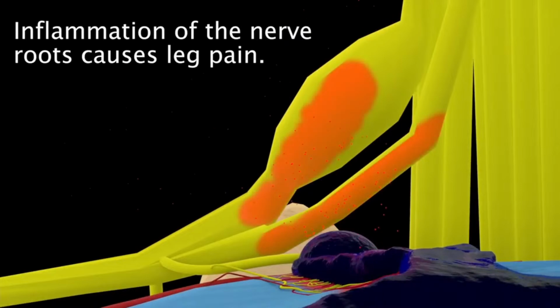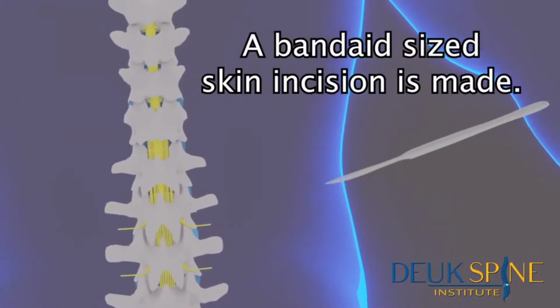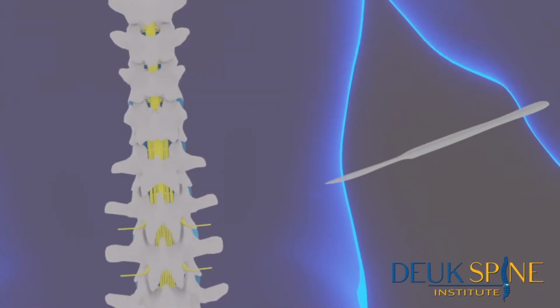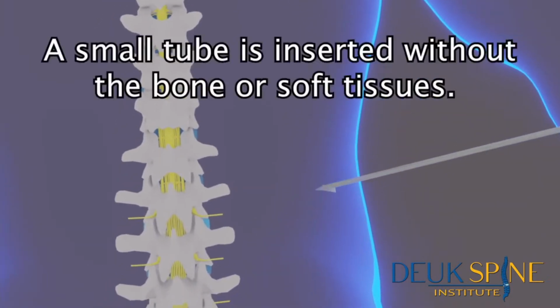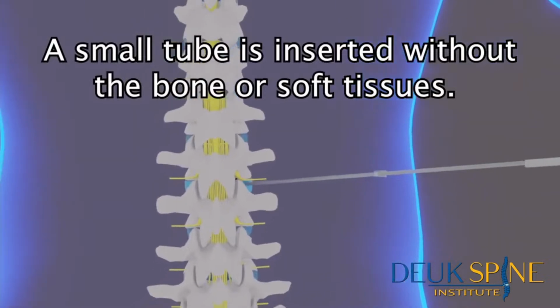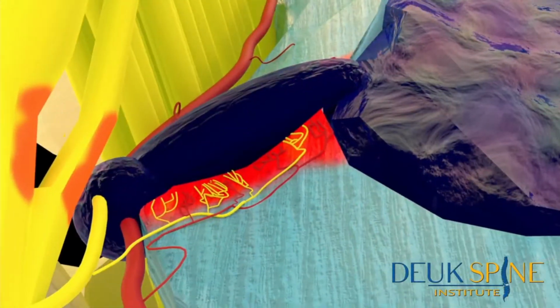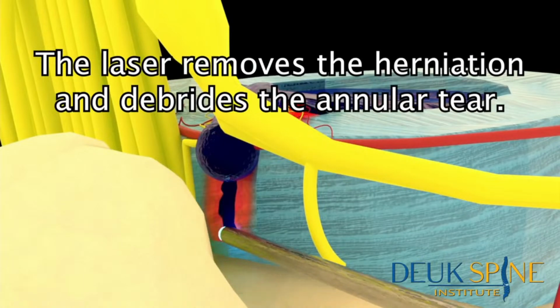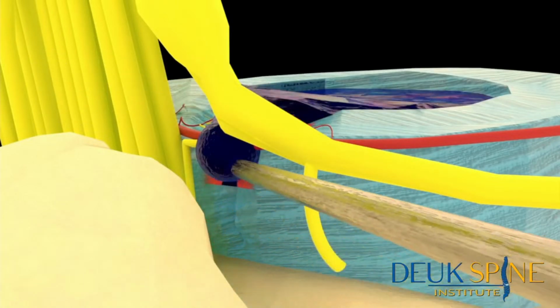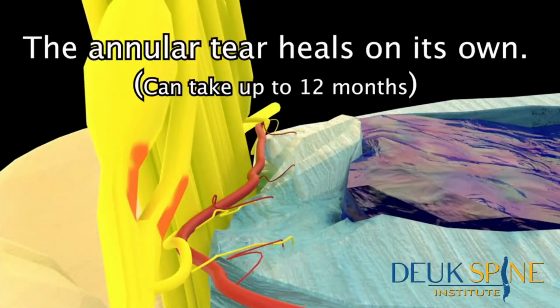Inflammation of the nerve roots causes leg pain. A Band-Aid-sized skin incision is made. A small tube is inserted without damaging the bone or soft tissues. The laser removes the herniation and debrides the annular tear. The annular tear heals on its own.